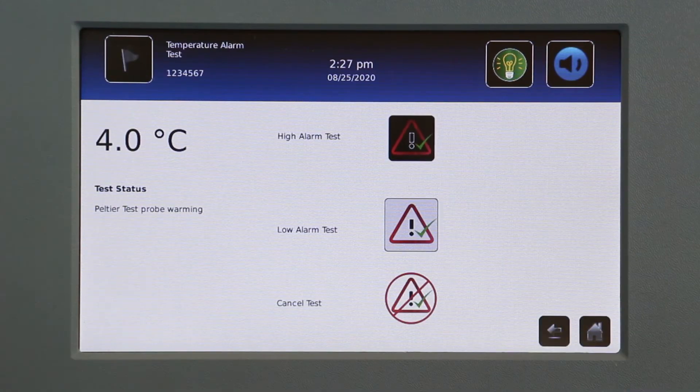The icon for the selected test begins to flash. Temperature changes are displayed in the temperature display on the left side of the screen. As the temperature moves into an alarm condition, the temperature reading turns red.